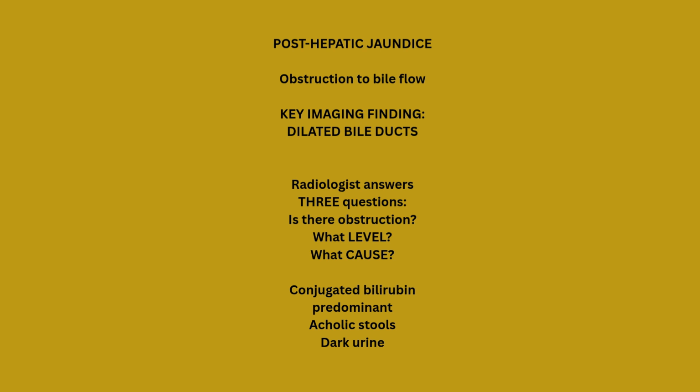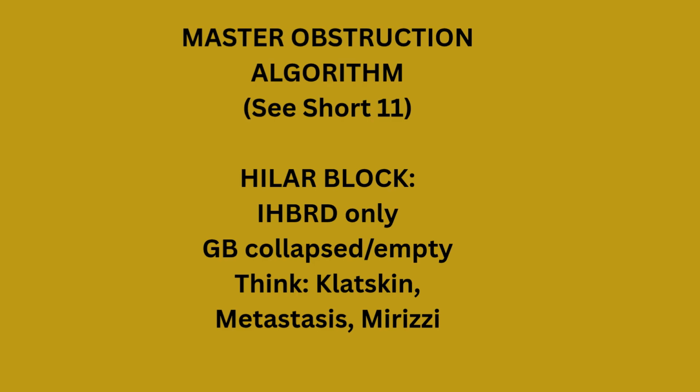Post-hepatic jaundice: obstruction to bile flow. The key imaging finding: dilated bile ducts. As radiologists, we answer three questions: is there obstruction, at what level, and what is the cause? The master obstruction algorithm: 3 levels, 3 stories.